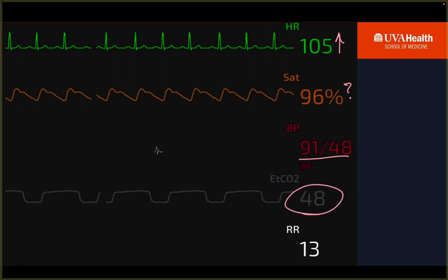Now, let's think about that for a little bit. If we think that you would expect a dead space of approximately this, and we think that it should still be, say, 0.2 with mechanical ventilation, you're not sure of that yet, but let's just test this hypothesis. We can't get an arterial CO2 short of drawing a blood gas, which is a little bit invasive in this circumstance, at this point anyway, unless other things manifest.